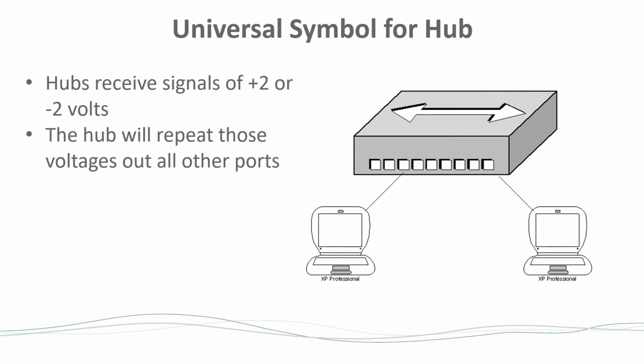Collisions, right? So what does a collision mean? A collision means that two devices are trying to use the same port at the same time. They're all trying to communicate at the same port. That's a collision. A hub is prone to collisions by its very nature. You're going to have collisions, and they don't do anything about it, typically. Even the smartest hubs typically will just flash a light when they see a collision. So you can watch that you're having collisions, but they don't offer you any remedy for collisions.